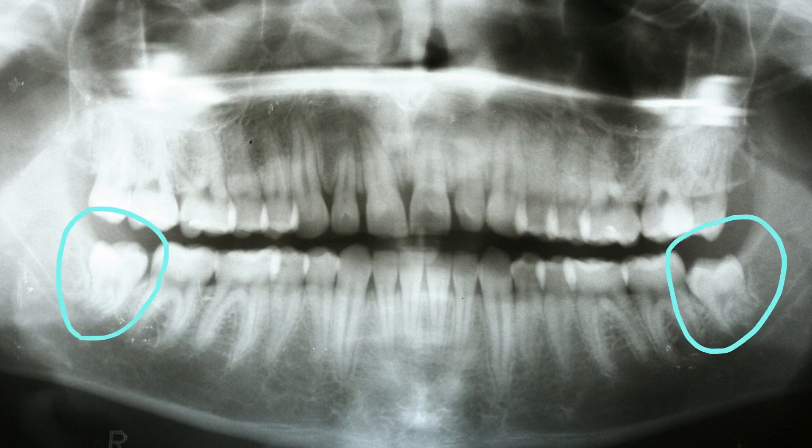The lowers are partially up. They're poking through the gums. The front part of the teeth are poking through the gums, but the back part is still covered with the gums. If you look close — let me highlight that for you — you can see where the gums are still covering this. And for these lowers too, if you look in the back, there's still a little bit of bone kind of covering the tooth.